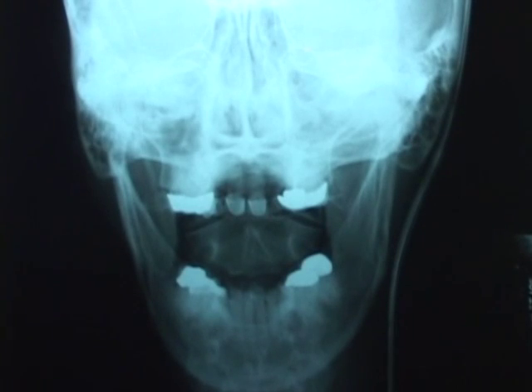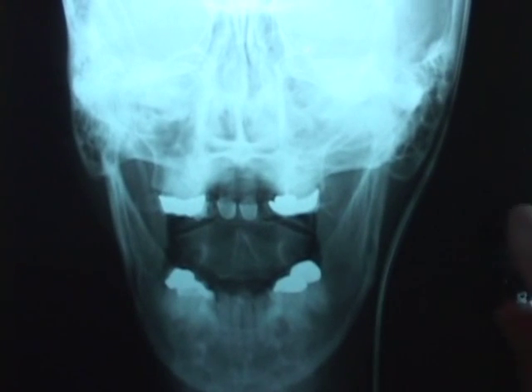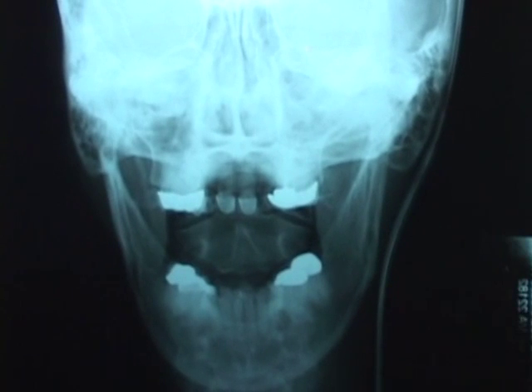This is a Parkinson's patient who has had a deep brain stimulator implanted. You can see the wires running down the side of her head, down her neck to her chest. The deep brain stimulator does not work. No one has been able to find proper settings for it.